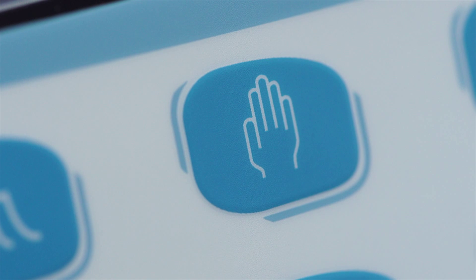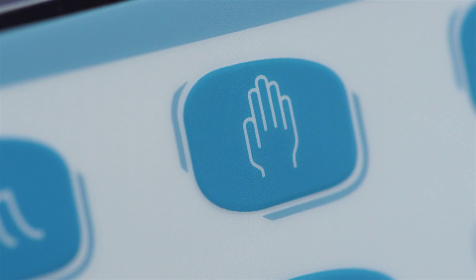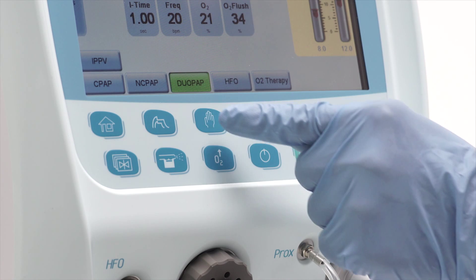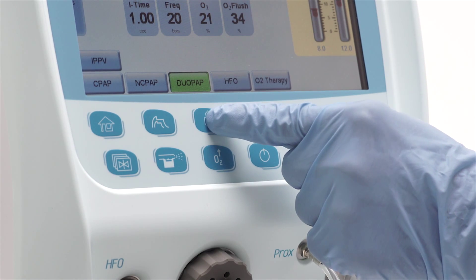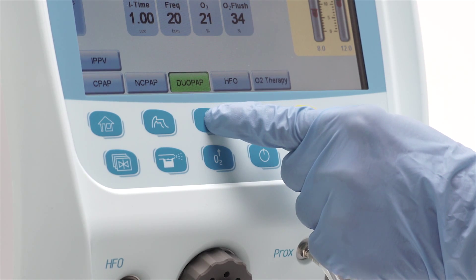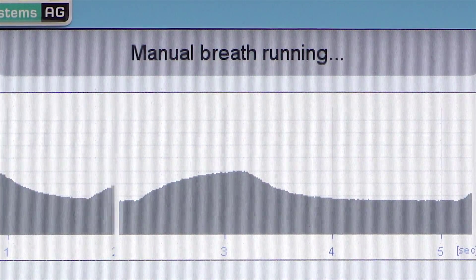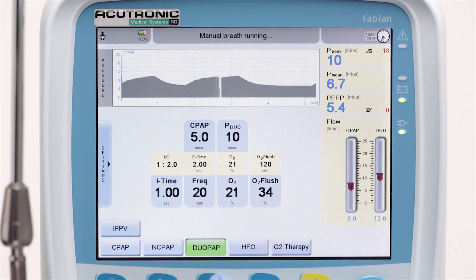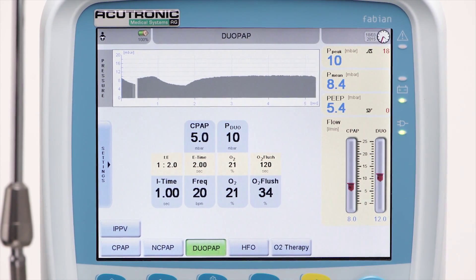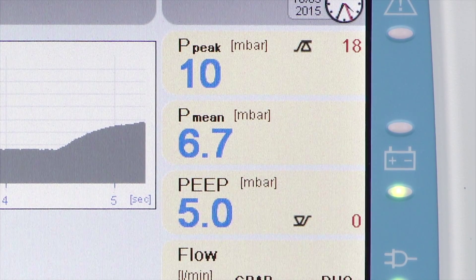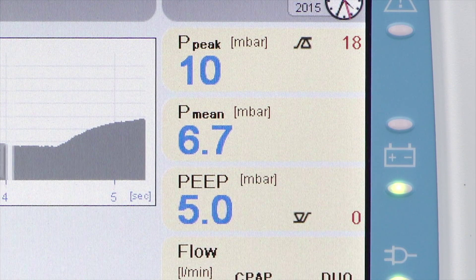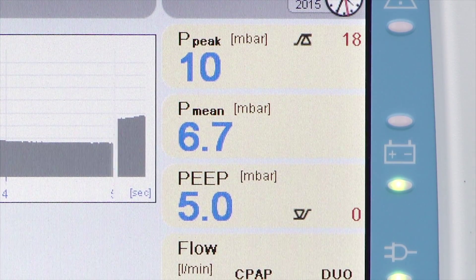The P-Manual button allows you to start and prolong the desired upper pressure level during a manual inflation to the patient in case of apnea or a lung recruitment maneuver. The measured values of peak, mean airway pressure, and PEEP are displayed.